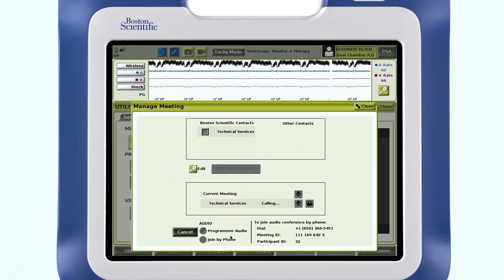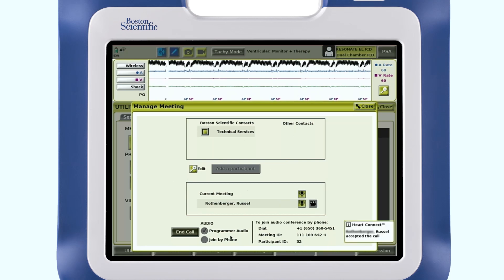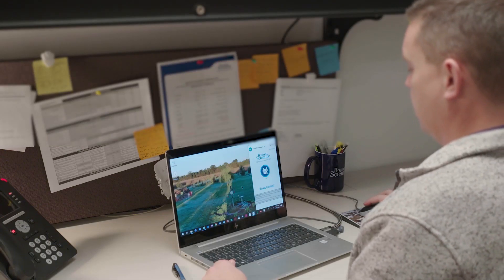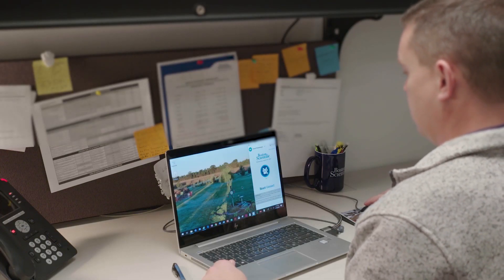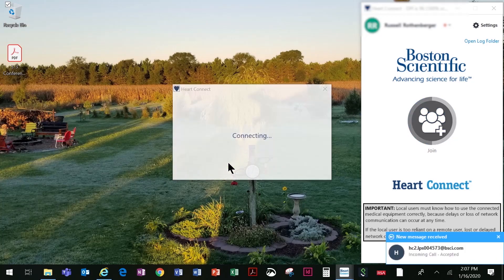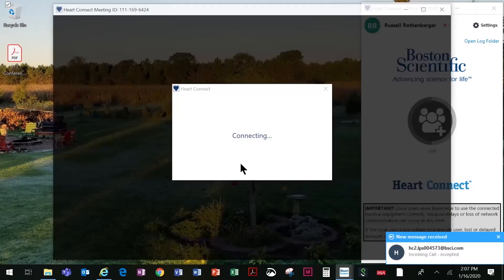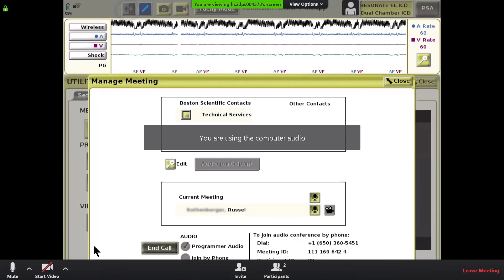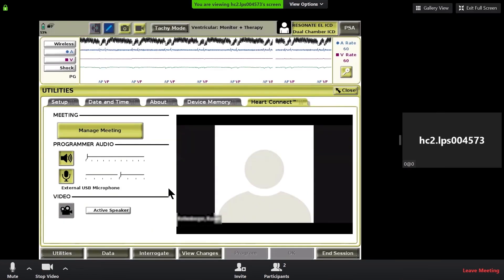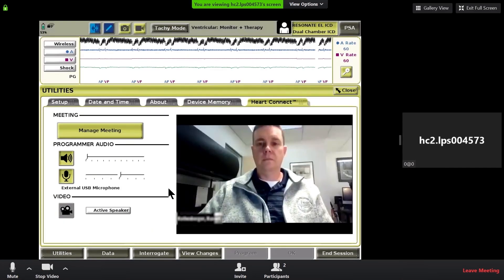The programmer will also display who accepts and/or declines a meeting invitation, as well as if there is no response. The remote user will need to accept the HeartConnect call. When the remote user accepts the call, the programmer screen will be shared, as shown by the blue blinking double-arrow button at the top of the programmer screen. An audio and/or video conference, if selected, is starting using a Zoom application.